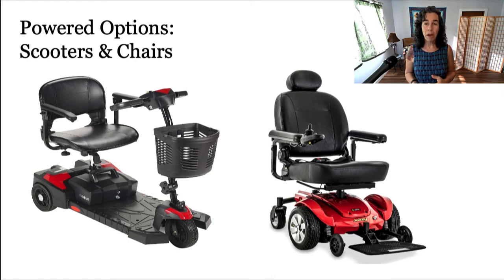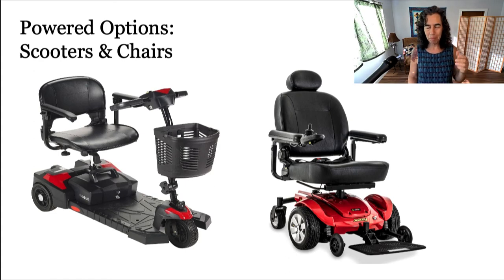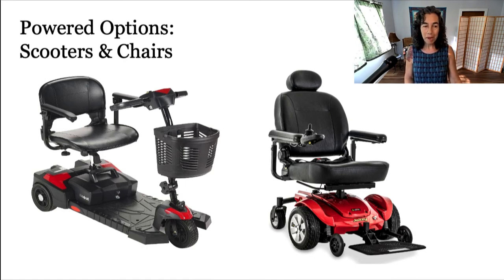We give powered wheelchairs to very young children, and that is purely to increase their mobility. And because they're young and developing, parents will have a remote, or it's also called a kill switch. So it's like a parental control, so you can stop the wheelchair so that kids don't go crashing into stuff. But it's not really a great idea to talk about a kill switch on an electric chair. So we use powered chair because it sounds a lot better.